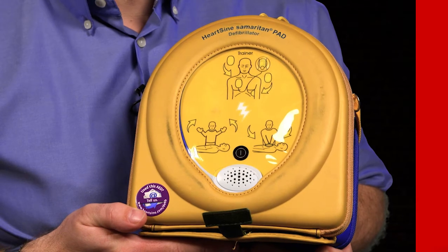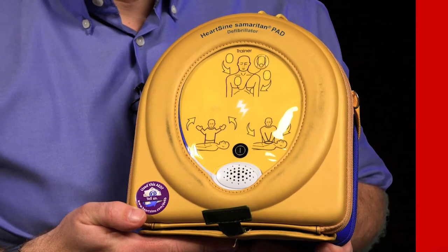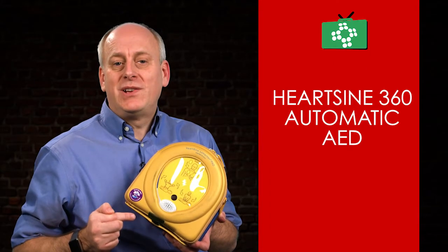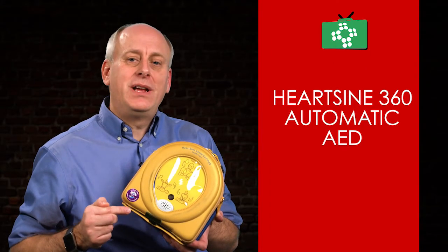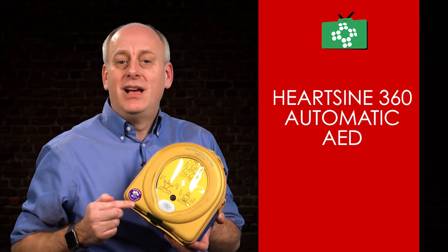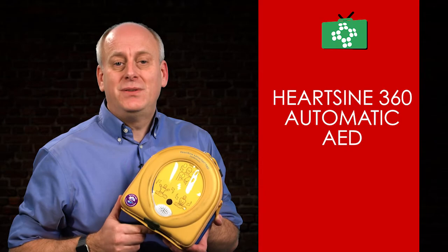The 360p also uses HeartSine's practical pad pack, the same as other HeartSine AED units, which incorporates the battery and the electrodes in a quick-replaceable single-use cartridge, meaning there is only one expiration date to monitor and only one item to replace after use.